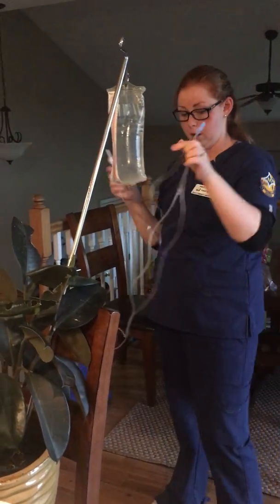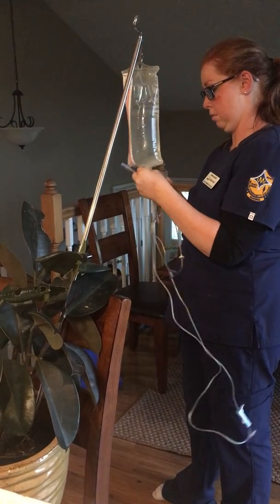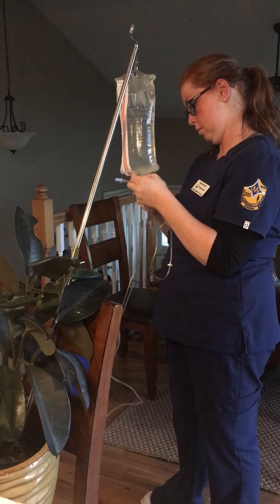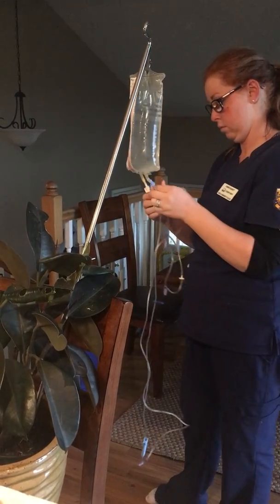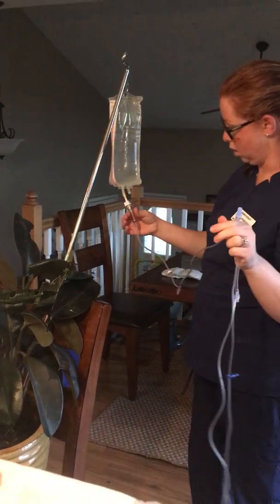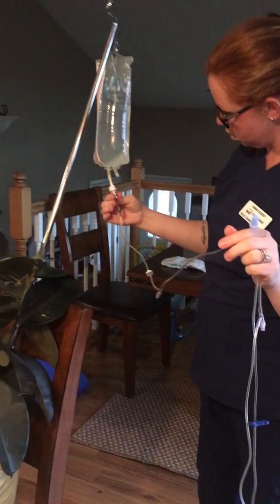So, making sure I have all my things closed, I can go ahead and spike the bag. And then I can go ahead and fill my drip chamber.